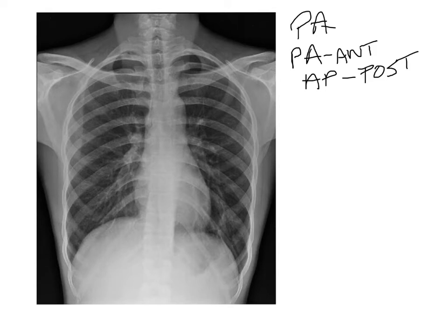So as we talked about in class, step 1 is to identify the area of pain, and we said that this was going to be anterior, so we will do a PA. Anterior, because we want the anterior ribs closest to the IR, and that is what our PA does for us. We'll talk about the third step when we do oblique ribs. But let's take a close look at this.